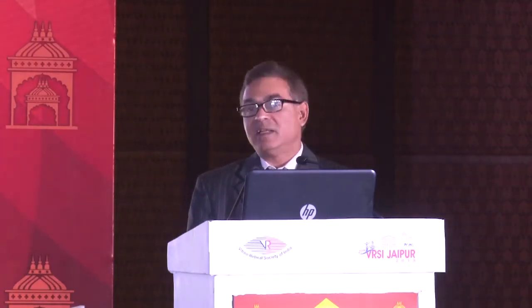So there are 2 essential maneuvers you need to know. One of them is being shown here. That is, you somehow get under the membrane and cut it. This is called cut and lift. This is safer, this is preferable as much as possible, but sometimes it's not. Then you have to use the cutter like a snow shovel or something, which you jam against the membrane. And of course you lower the vacuum. So there are 3 final points I'll talk about.